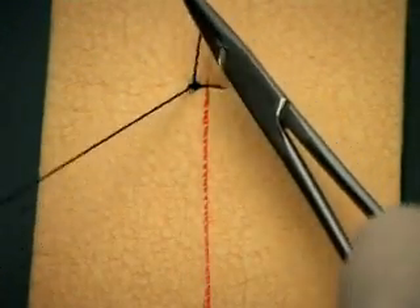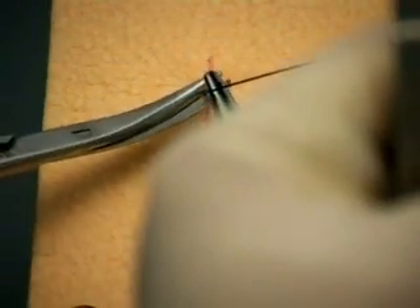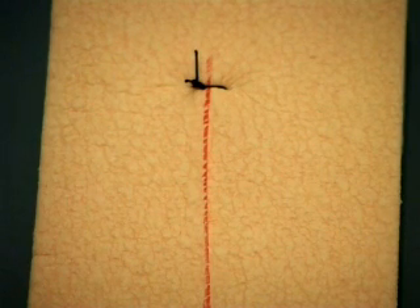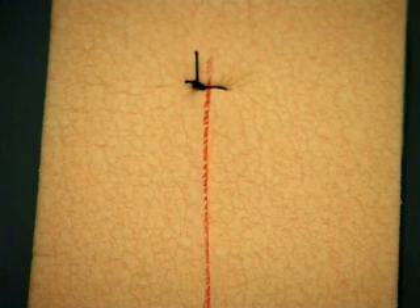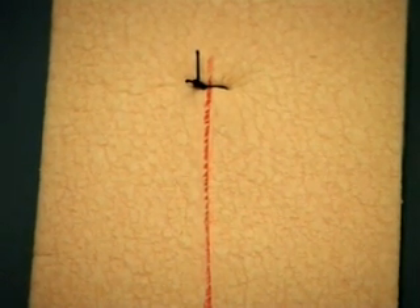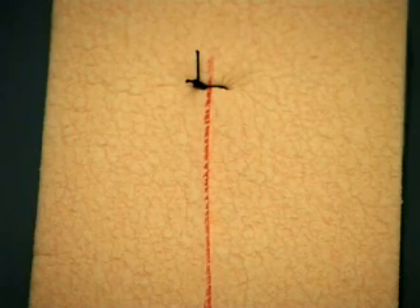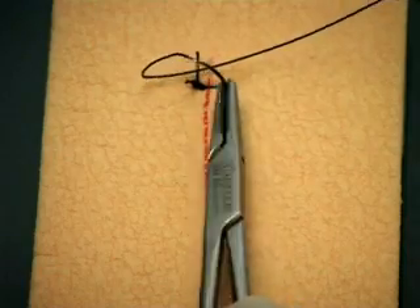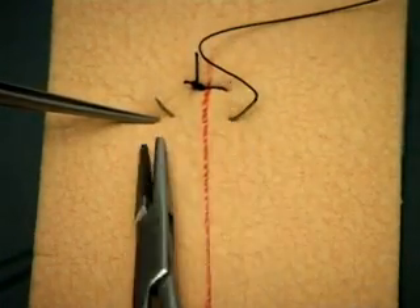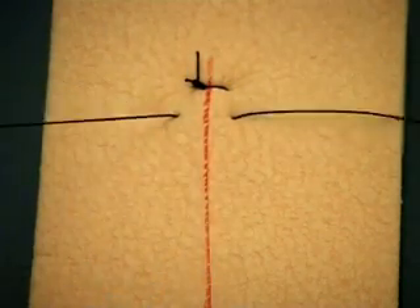Hold the sutures together in this fashion and your assistant will cut it for you. Cut the suture to an appropriate length — too short and there is a danger of the knot slipping; too long and it comes in the way of the next suture. Note the rotatory movement of the needle holder by a pronation to supination movement of the hand. Try to place your sutures evenly from each other and equidistant from the wound edge.